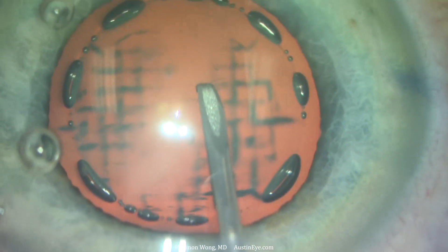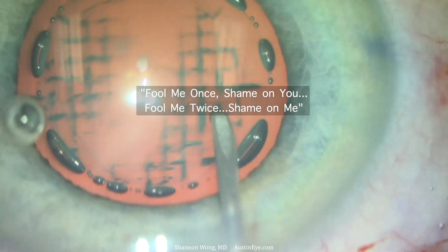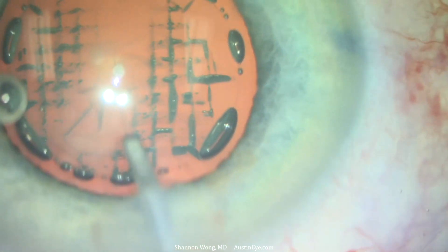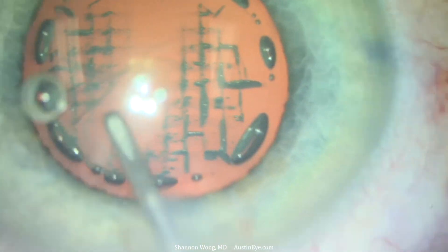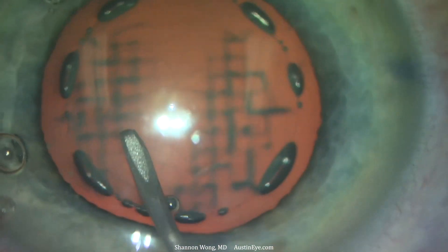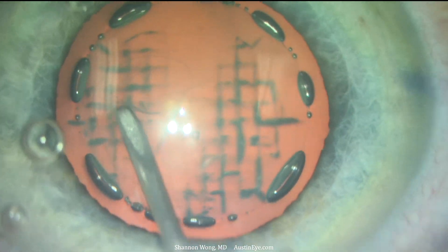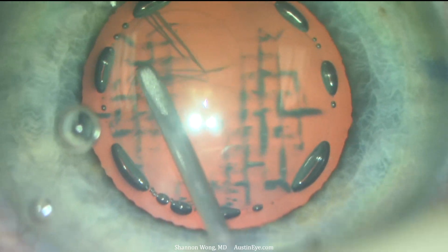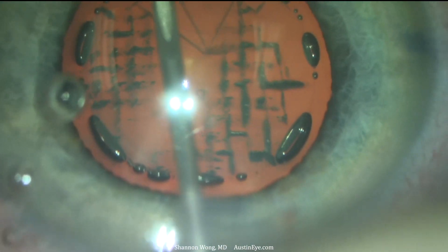As the saying goes: fool me once, shame on you; fool me twice, shame on me. Recognizing that this bubble pattern of the LensX femtosecond laser capsulorexis was virtually identical to the pattern seen the month prior, I planned to make a manual capsulorexis with a diameter smaller than the 4.8mm programmed capsulorexis performed by the femtosecond laser.